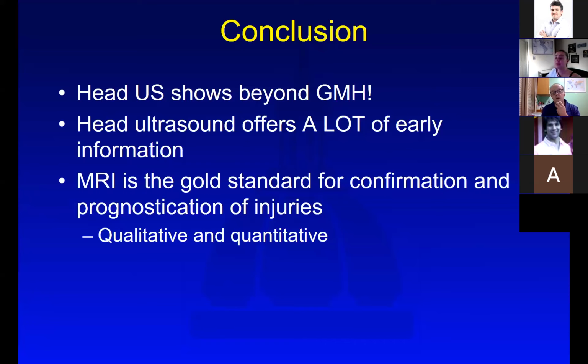Here in Brazil, sometimes we still struggle with not having easy access to MRI, and sometimes we go for CT more often than we would like to, due to constrained resources. So I'd like to hear from you, in your practice, what amount of CT do you perform in your center? Close to zero.